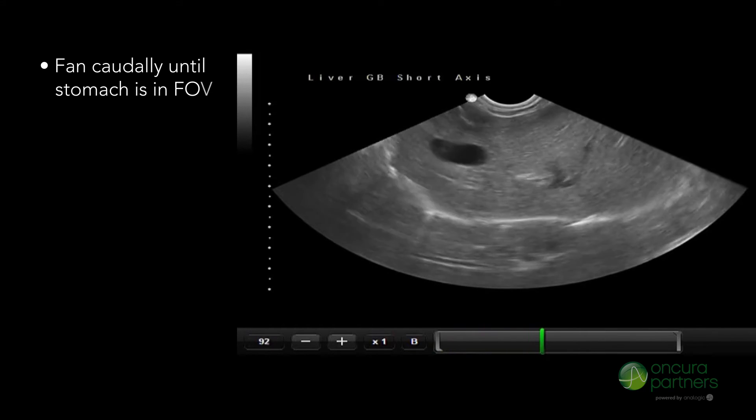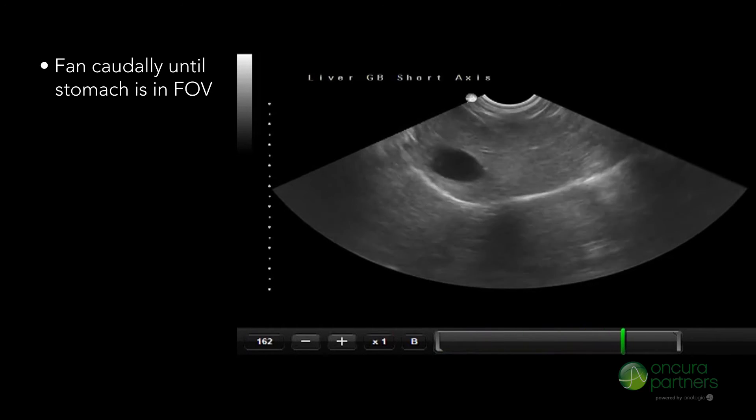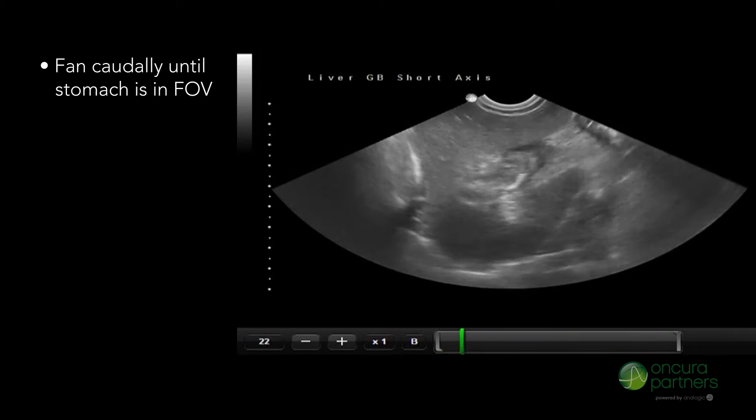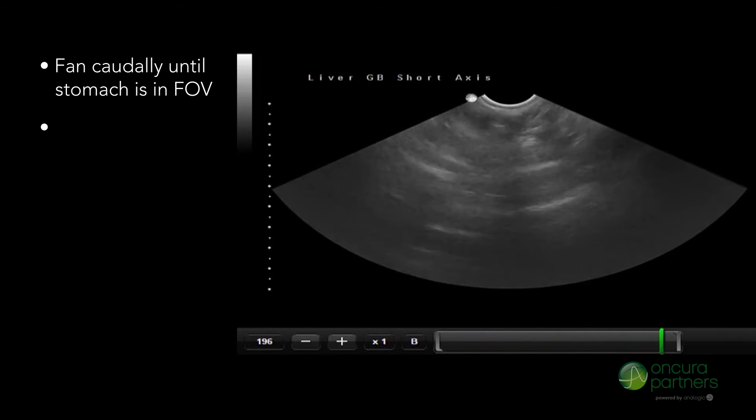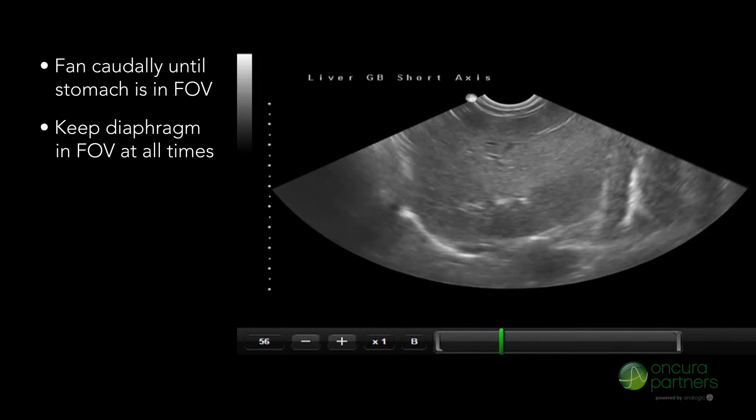Then fan caudally until the liver parenchyma is no longer seen and the stomach is in the field of view. Evaluate the right and left sides of the liver, keeping the diaphragm in view.